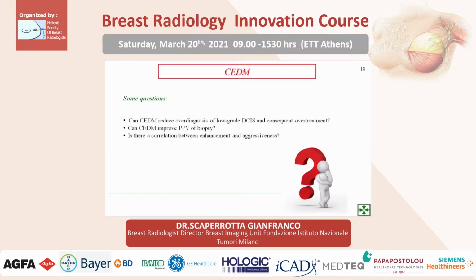But there are some questions, important questions about CEM. Can CEM reduce overdiagnosis of low-grade DCIS and consequent overtreatment? Can CEM improve the positive predictive value of biopsy? Is there a correlation between enhancement and aggressiveness?